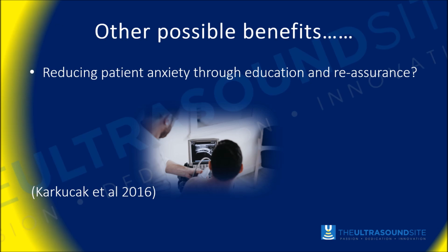So patients feel really reassured, if you like, by the fact that you are actually guiding the needle accurately to the target tissue. So they may have less concerns whether or not that's going to improve the treatment outcome, but they like to know that you are putting the needle exactly where you want it to go. And this can give a lot of reassurance, and also help to educate the patient about the condition and the treatment that they're actually receiving.